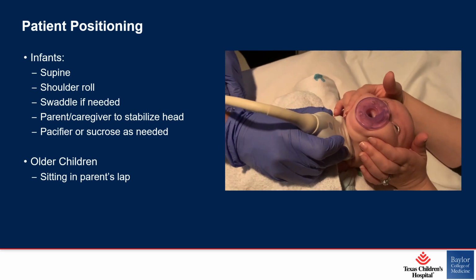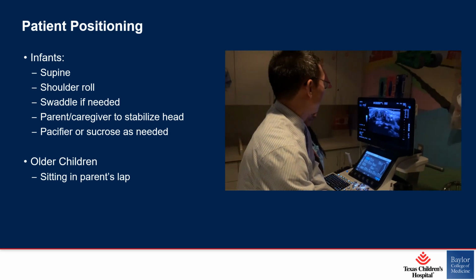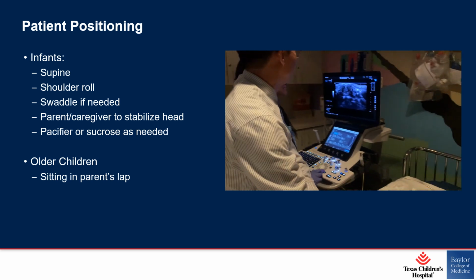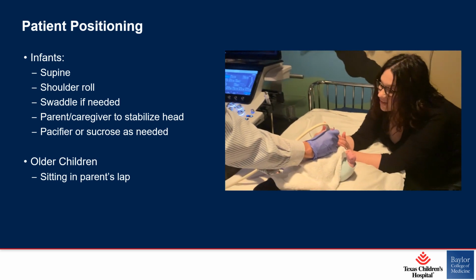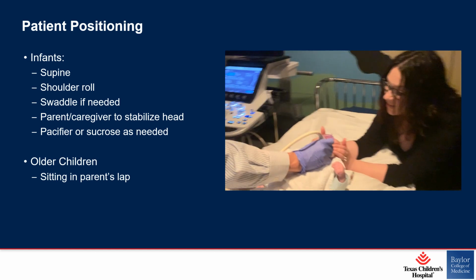Older children can be positioned sitting in the parent's lap. A video or other distractors can be useful. However, a lot of kids do like watching the ultrasound and watching their larynx move.